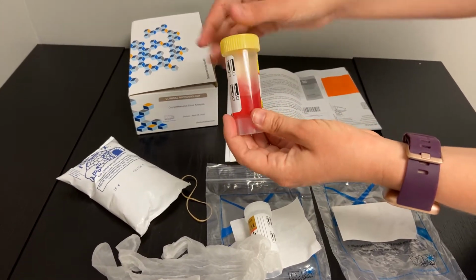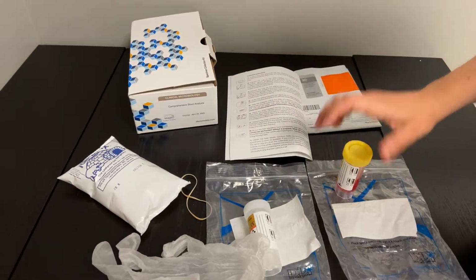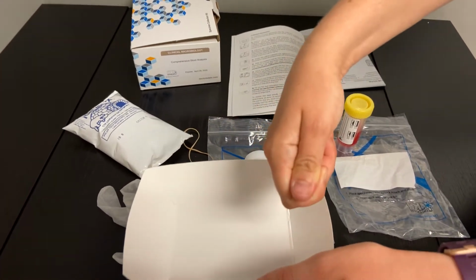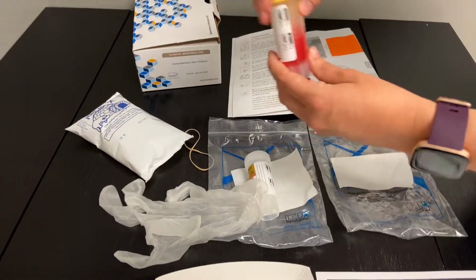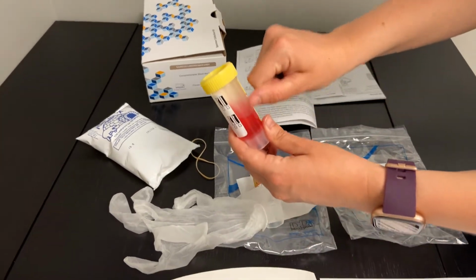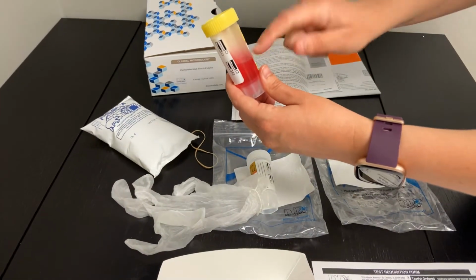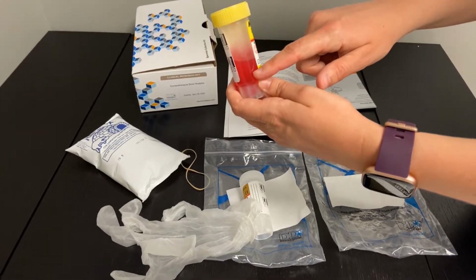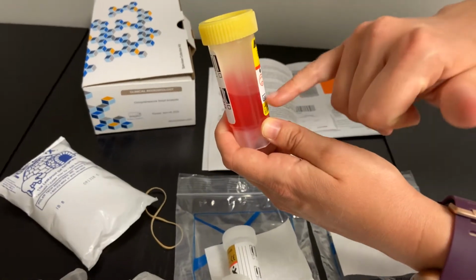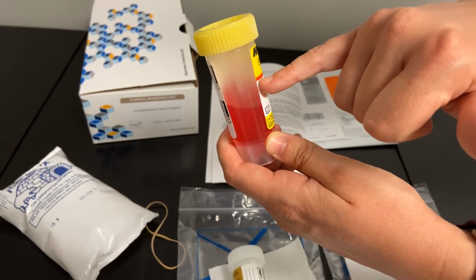So what you'll do after you've had your bowel movement, you'll uncap this, and then you'll use that lid and the spatula to scoop the beginning or the first portion of the stool that came out, and drop that into the vial. The middle portion of the stool that came out, same thing, drop it into the vial, and then the last portion of the stool that came out, and then drop it into the vial. That will then displace this liquid in order to make room for that stool, and it will cause it to go a little bit higher towards that red line.